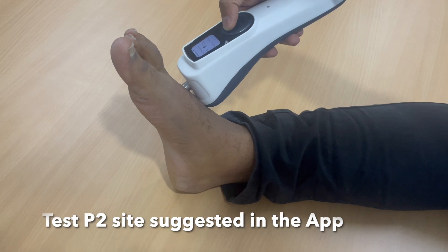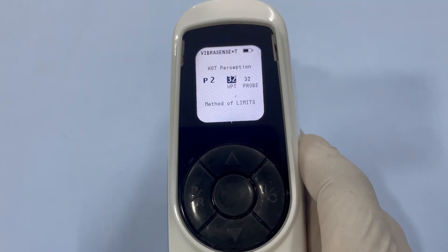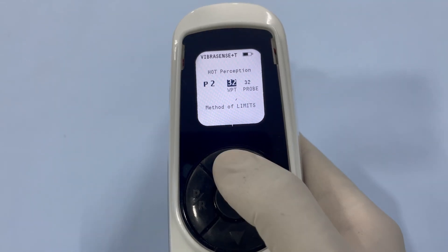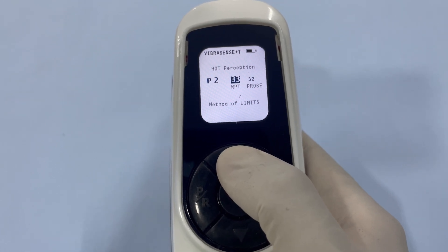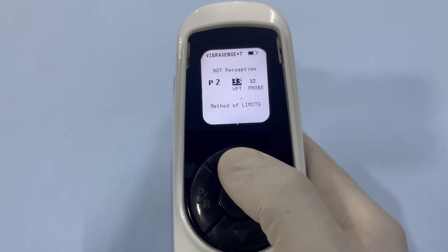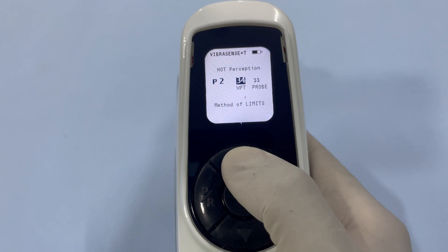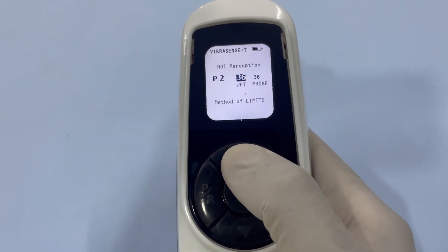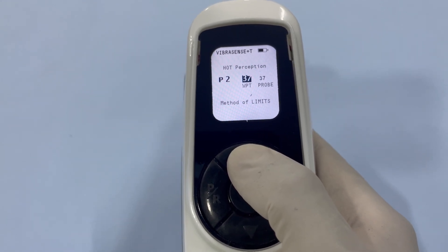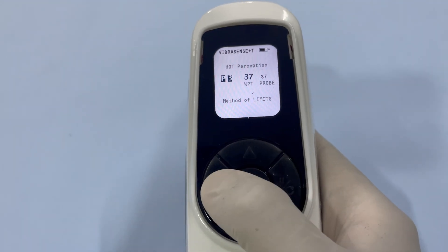Then repeat the procedure at P2, increasing the warm stimulus until the subject confirms feeling it. Proceed to test at P3 and P4.